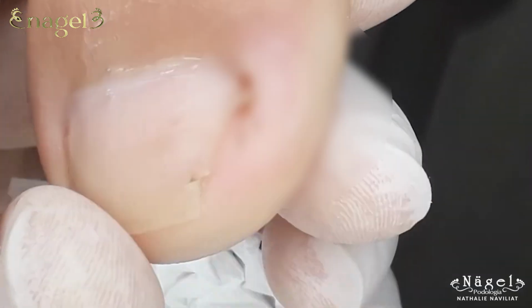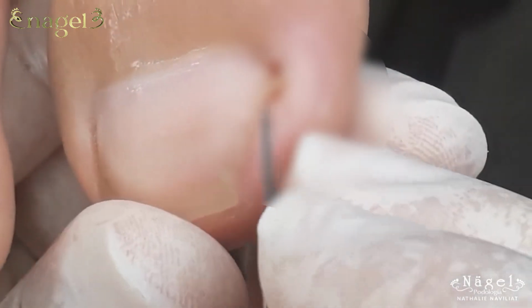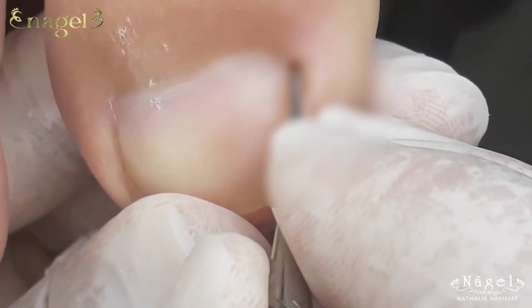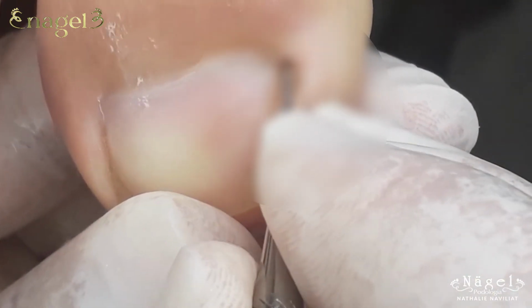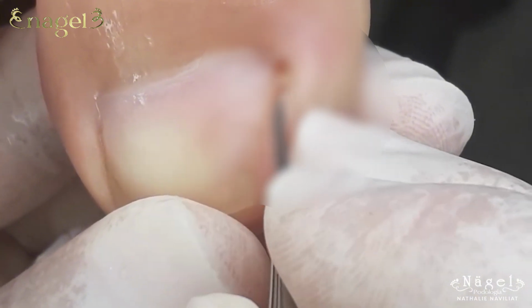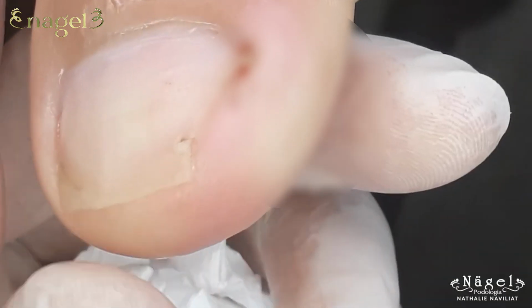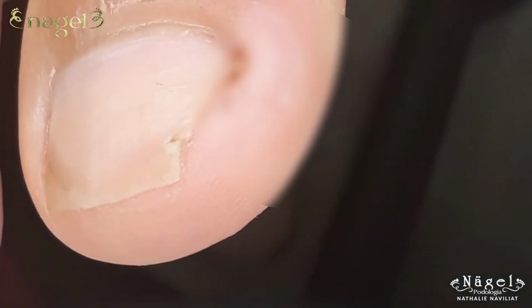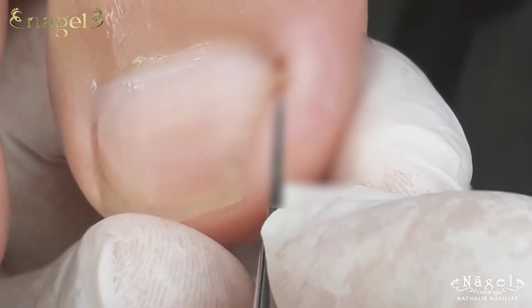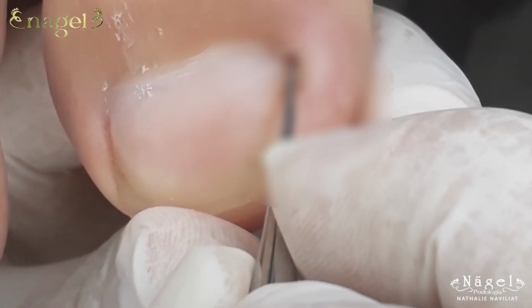He mentions that 2 years ago he had an issue with this toenail, and since then improper trimming made things worse. As a podiatrist, my trained eye kicks in to pinpoint exactly where this spur is and how to remove it safely. First, I clean the area thoroughly with an antiseptic to ensure everything is completely sterile. This is critical to prevent any risk of infection.